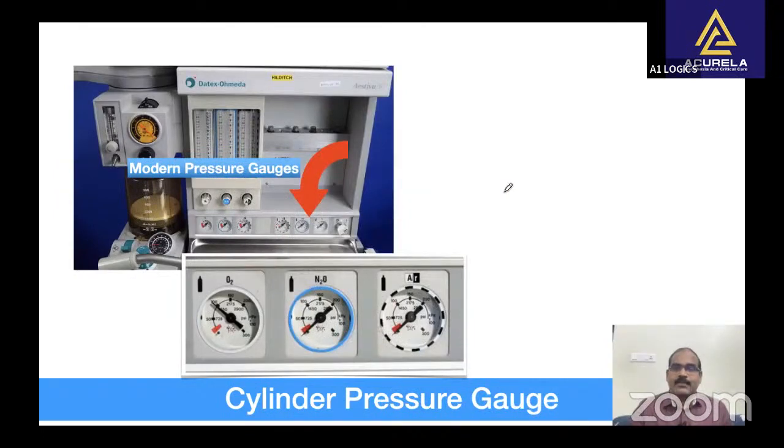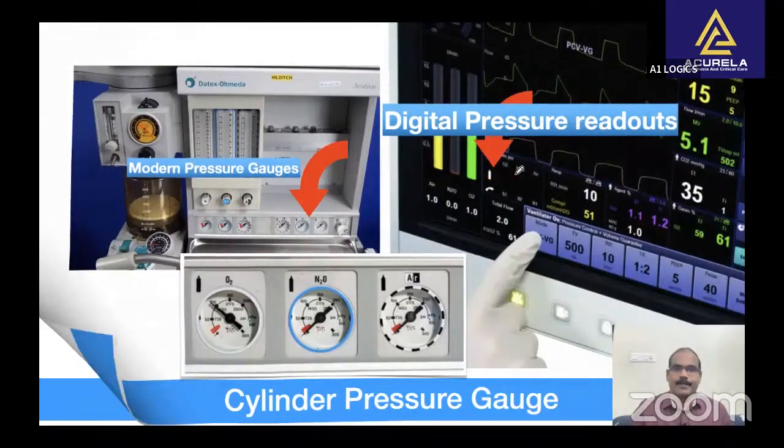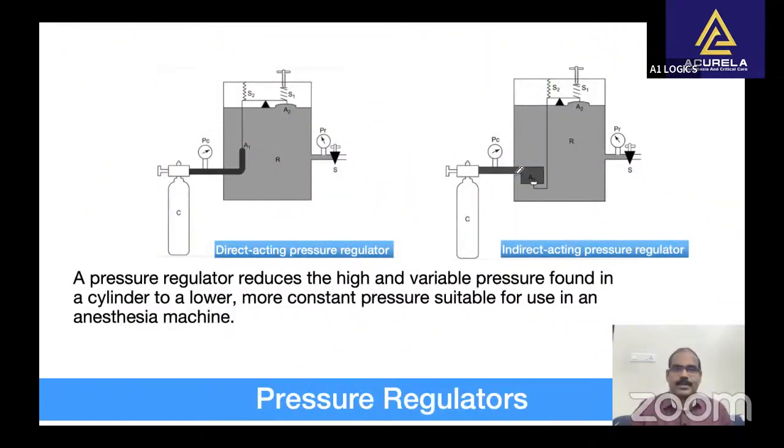In anaesthesia workstations, cylinder pressure gauges are seen in the front panel for each gas. Digital pressure readouts are used on some modern electronic anesthesia workstations. The pressure in a cylinder varies.